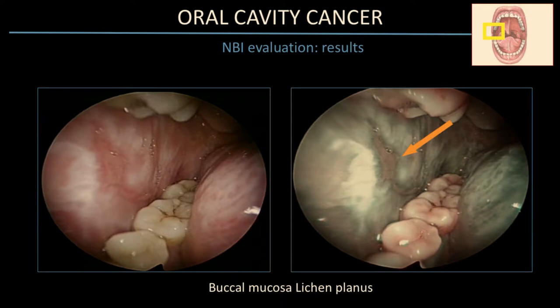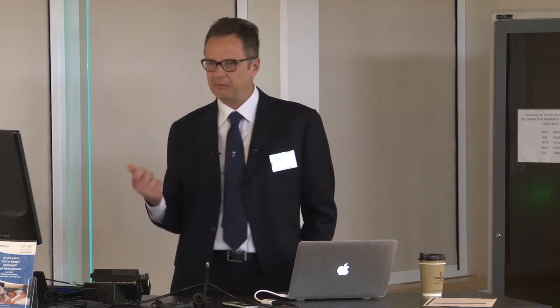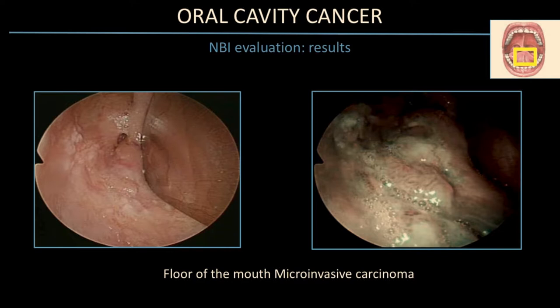NBI plays an important role in following lichen planus cases. In diffuse erythroleukoplakia, you don't know where to take the biopsy because the entire mucosa appears altered. NBI is very useful to address the right place for biopsy and also helps follow the patient without performing unnecessary biopsies, significantly reducing patient morbidity. Another case of microinvasive carcinoma again shows the different appearance between white light and NBI.